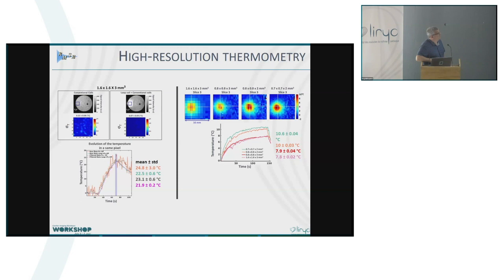So you can clearly see here that the orange curve shows the standard uncertainty of the measurement of temperature during a heating. And if you simply use the coil itself alone, you can go from the orange curve to the green curve, which is much more precise.